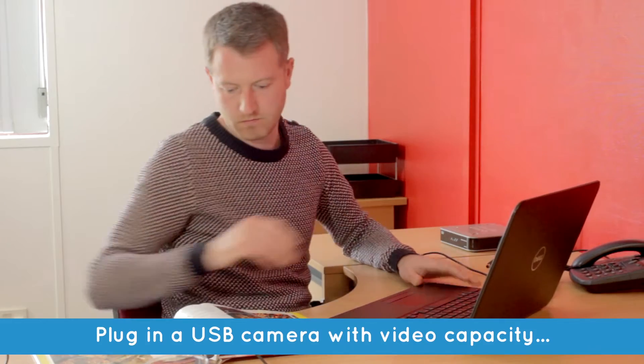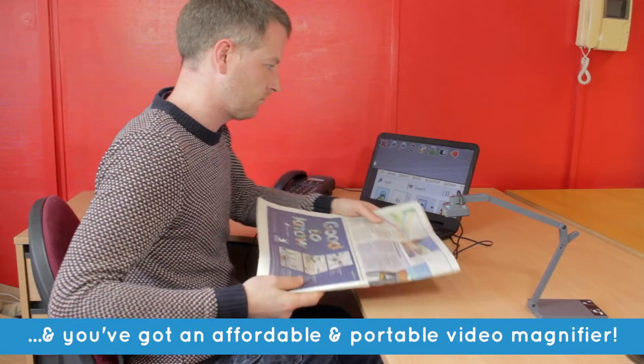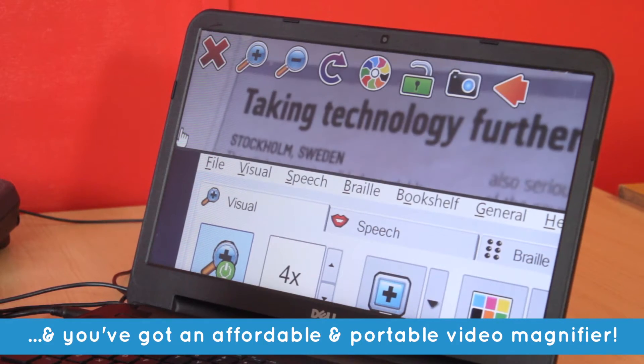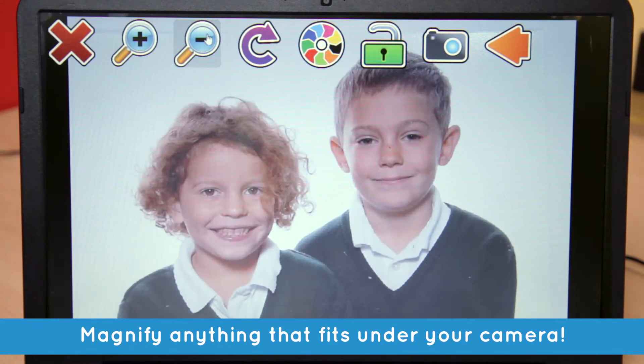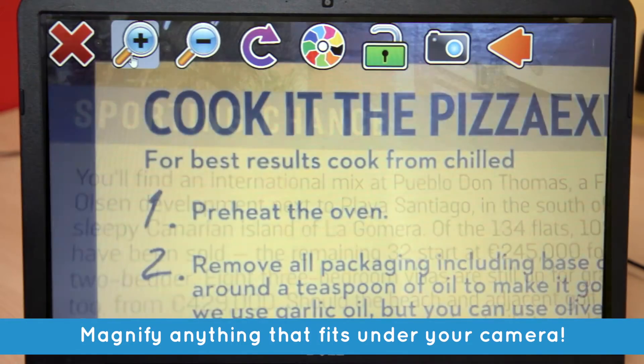With Supernova's Connect and View, you can plug in a high-definition camera and your tablet, laptop, or desktop computer becomes a video magnifier. Magnify letters, maps, photos, packaging, newspapers, or instructions.